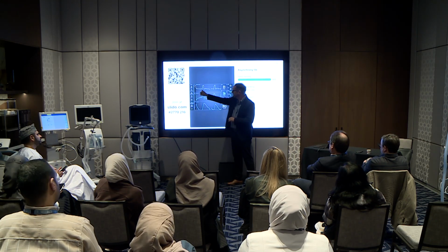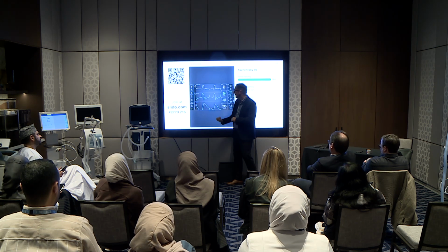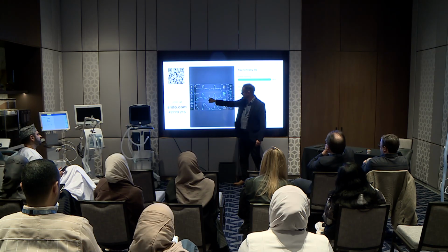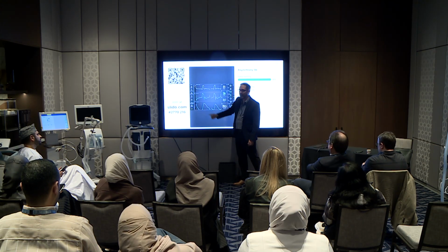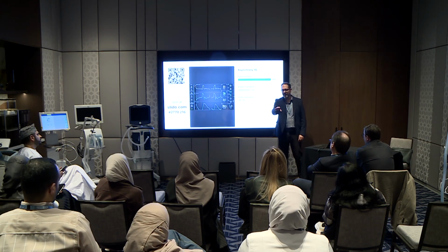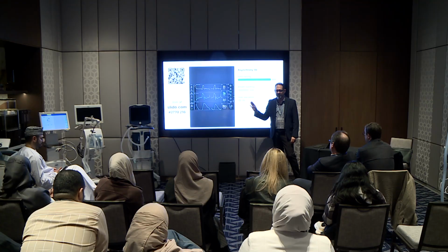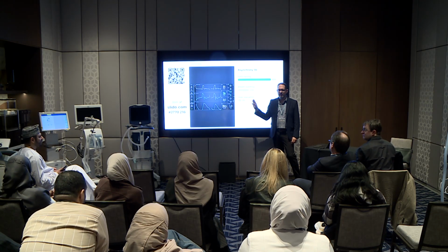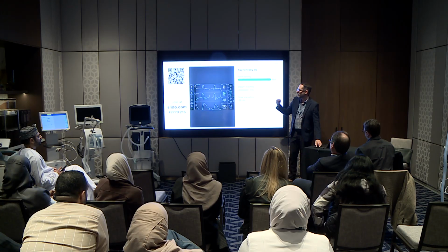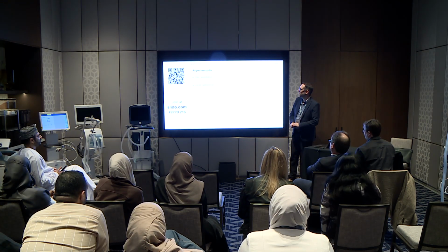The patient is triggering. Ventilator cycles off. There's that evidence of ongoing inspiratory activity. Now, if this flow was high enough, it could result in breath stacking. So I don't know if my question said what it is, or what could be a problem, or what's the most common. How would you classify it? Yeah, so early cycling is how you classify it. If the question was, what could be a potential consequence of this, breath stacking is the potential consequence.